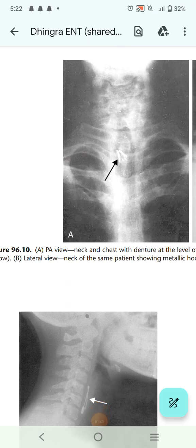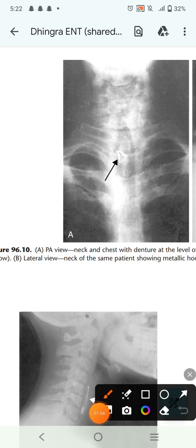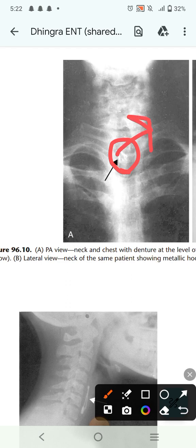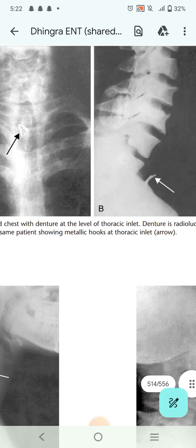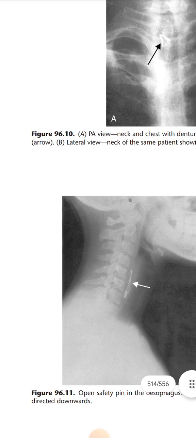After that, write the view — PA view, lateral view, whatever it is — then the region (neck, skull, chest), and then write the abnormality. For example, here you can see dentures, which are artificial teeth. Part of them is radiolucent while the metallic hooks are radio-opaque. So you write: 'PA view, neck and chest, with dentures at the level of the thoracic inlet.' This is the lateral view of neck and chest with the same metallic hooks at the thoracic inlet.